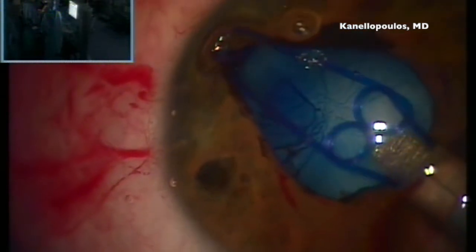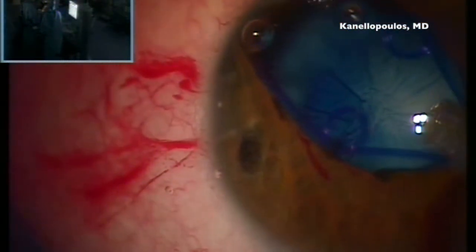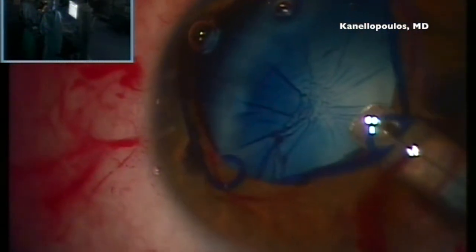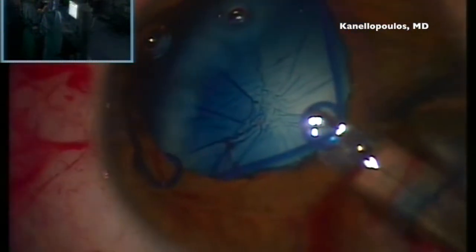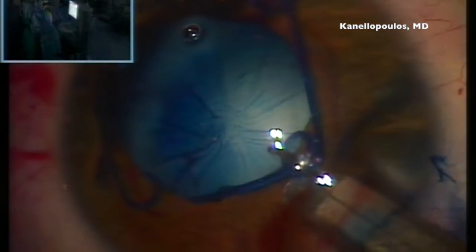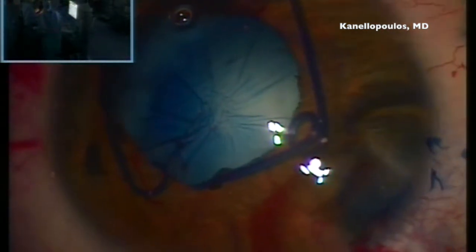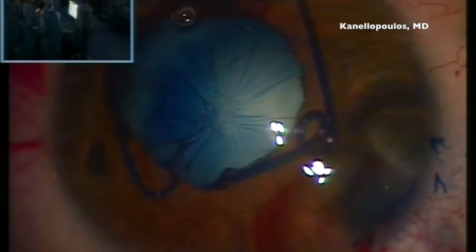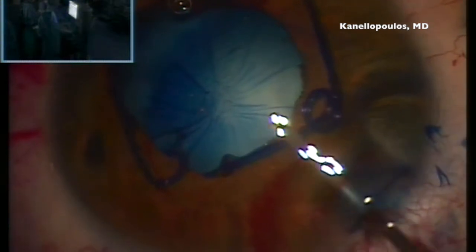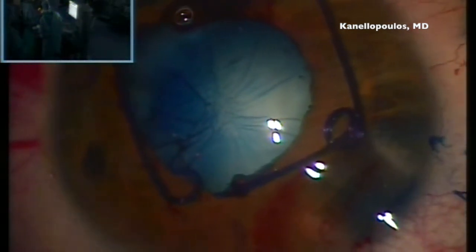The little curl of this Prolene continuous wire will also serve as a holder for the iris. So with gentle control, we can get all first three levels of fixation, and we're left with a residual spring. I have not used it much, probably 30 to 40 times, as most of the time I can get away with dilating the pupil with epinephrine, stretching as we saw before with Kuglin hooks, or a collar button forceps.